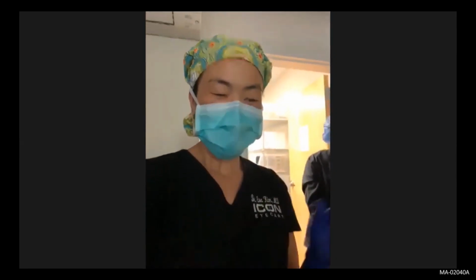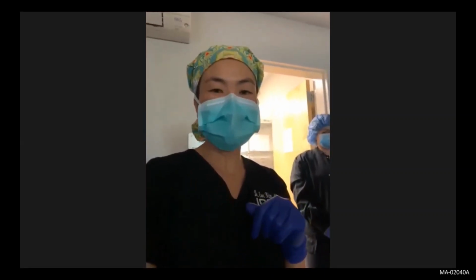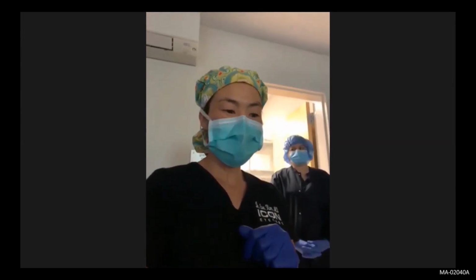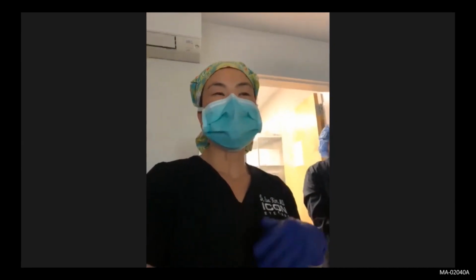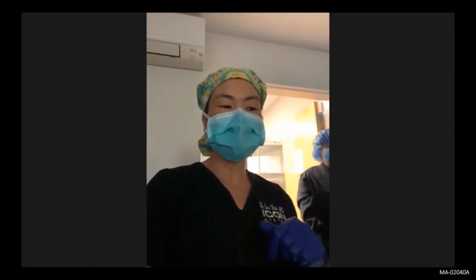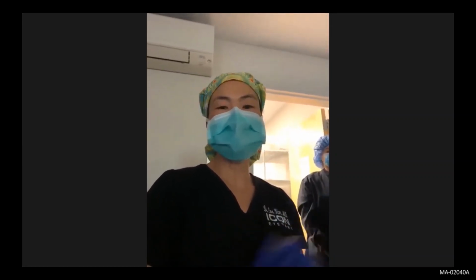And once this part is finished, once we go through these next 30 minutes, we will place a bandage contact lens on the patient, obviously for comfort. And then we'll see him tomorrow. We'll see him at a week. We'll see him at a month. And typically we won't recommend moving on to the next eye until, depending on the patient, 3 to 6 months later.